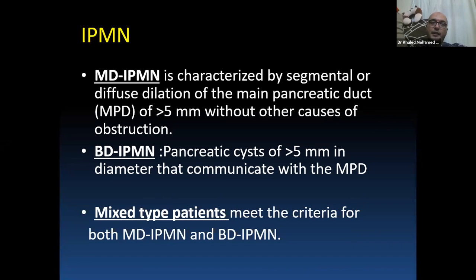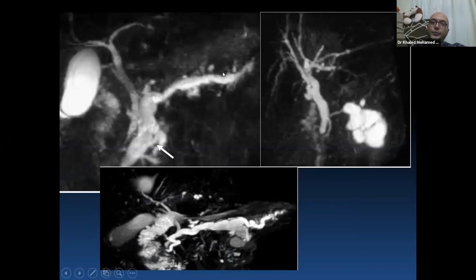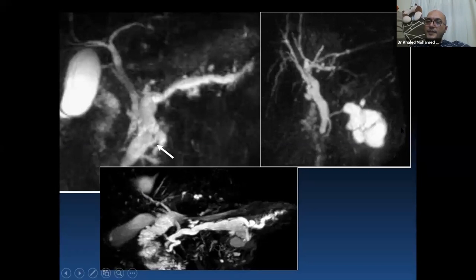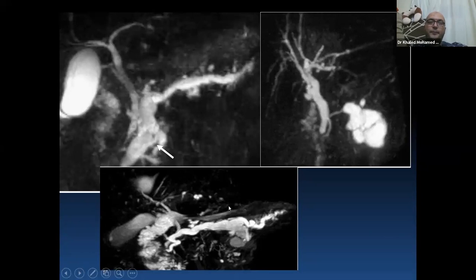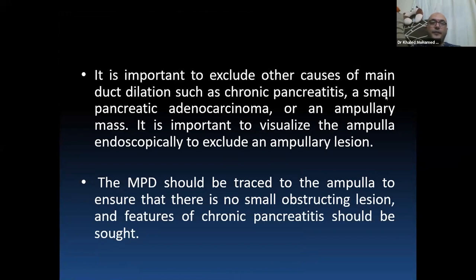In main duct IPMN, diffuse homogenous or segmental dilatation of the main pancreatic duct is seen without a definite cause for dilatation. Side branch IPMN presents as a cystic lesion more than 5 mm connected to a normal caliber pancreatic duct. Mixed type shows a combination of features of both main duct and side branch IPMN.